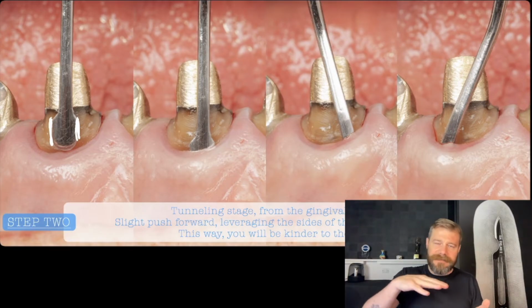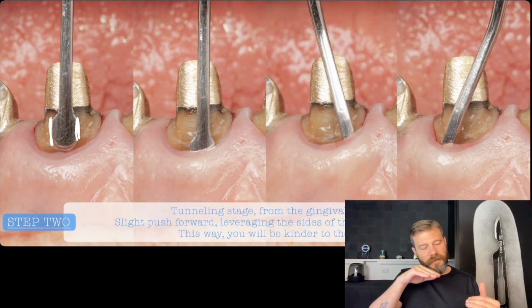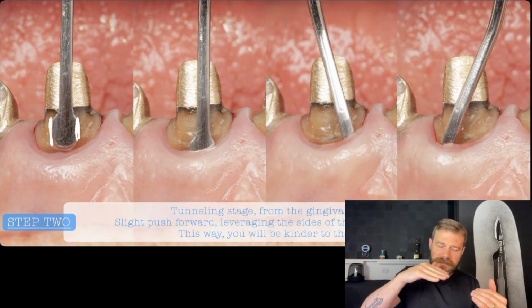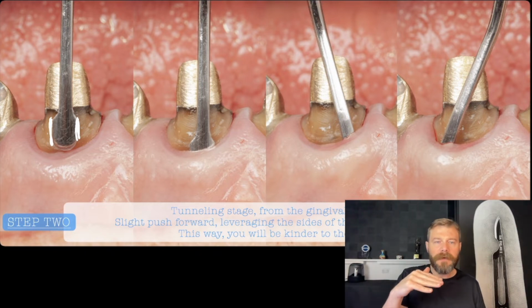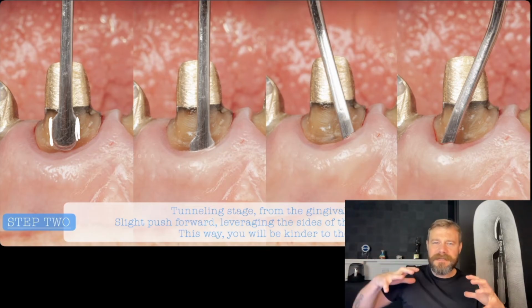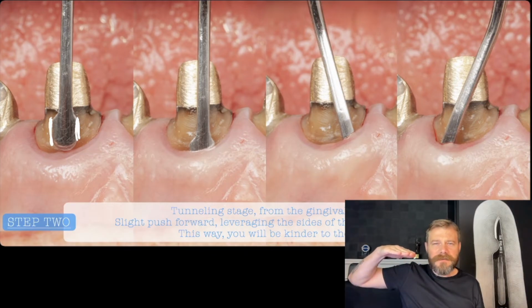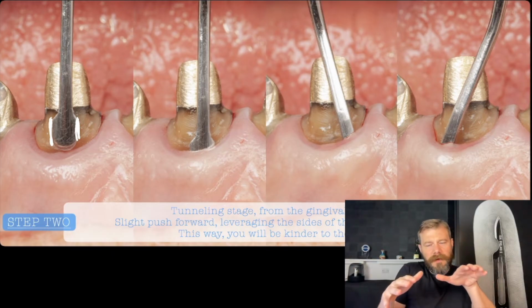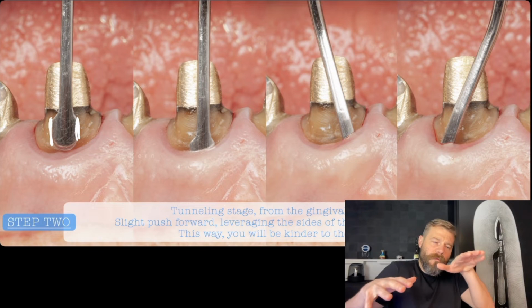When you are doing a tunneling, you are detaching the keratinized attached gingiva, you are detaching this tissue. You, of course, need to move this instrument forward, but you cannot apply a lot of pressure in this forward movement to detach the tissue. Sometimes you hurt the tissue, sometimes with a more sharp instrument you can even perforate the flap. And so when you are moving and detaching the attached gingiva, you apply a small pressure forward, but you move these instruments sideways. Moving the instruments sideways, one lateral side of the instrument, when you move, really holds on the ground, holds on the bone.